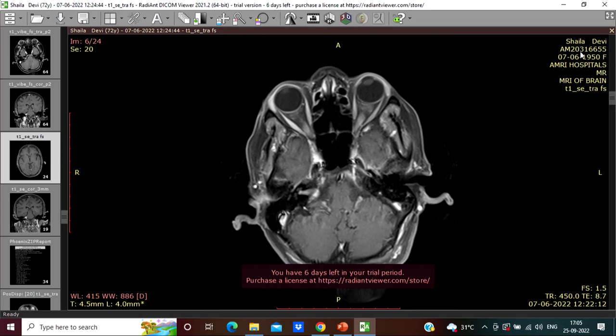You remove the core of the tumor from inside, debulk it, and mobilize the rest of the tumor in the field, and you can keep removing. Keep debulking, keep mobilizing in the field, and you can remove any big tumor through whatever narrow approach you have. So size is not a criteria.